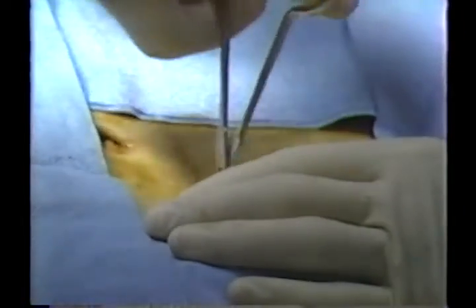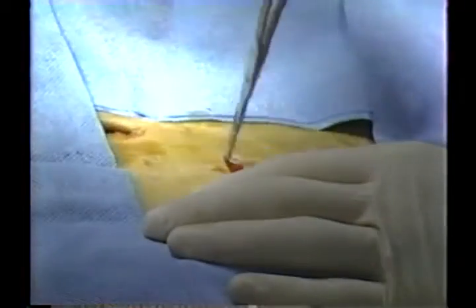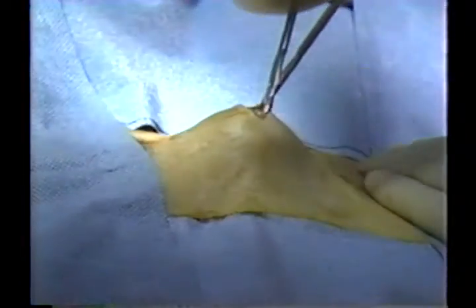Using a hemostat, blunt dissection is carried out to the rectus sheath. The rectus sheath can be felt and identified by inserting a finger into the incision.